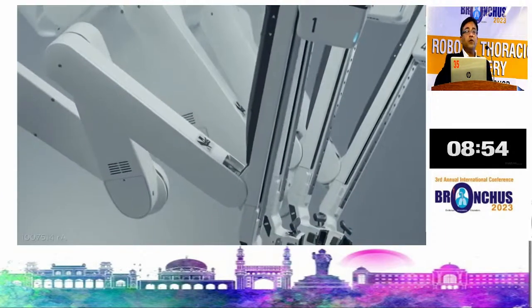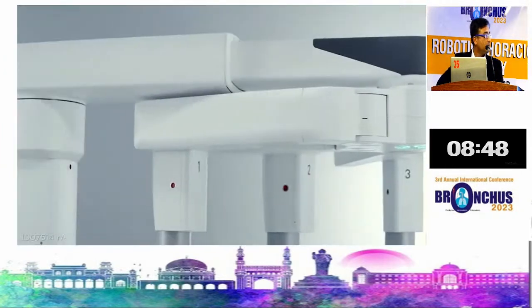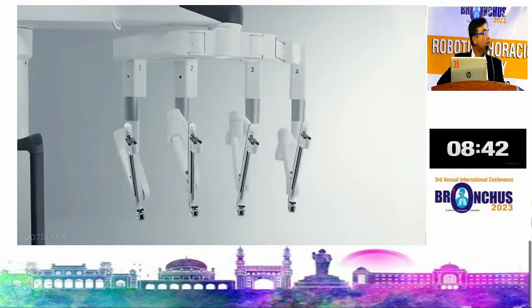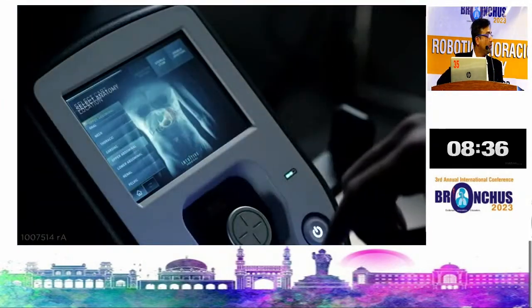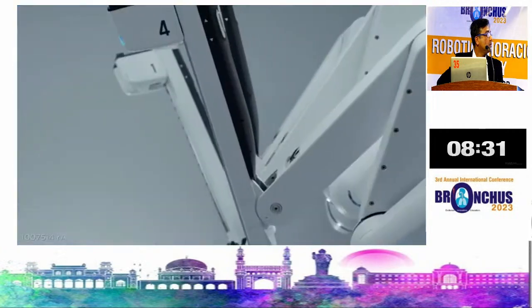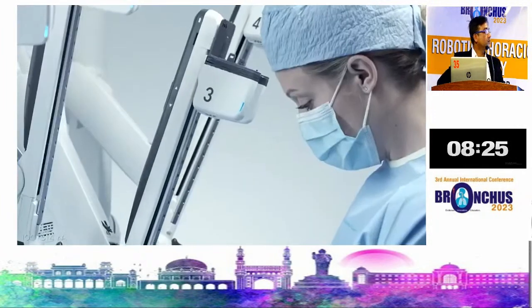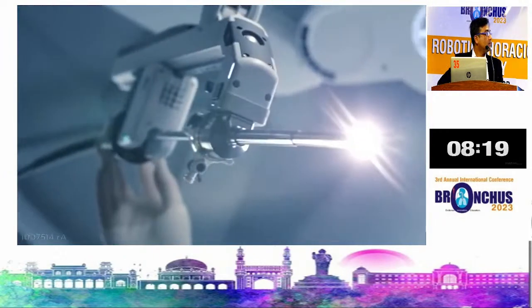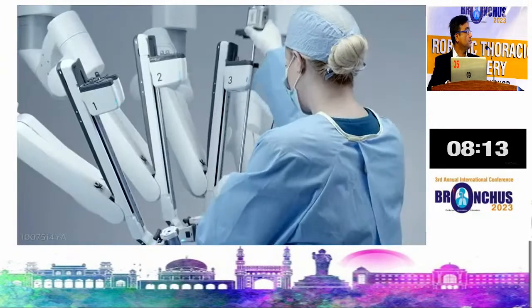These are the EndoWrist instruments, and this is how a typical EndoWrist instrument works. We call it the boom rotation, and it has a 270 degree rotation. That's the 8mm 3D endoscope.